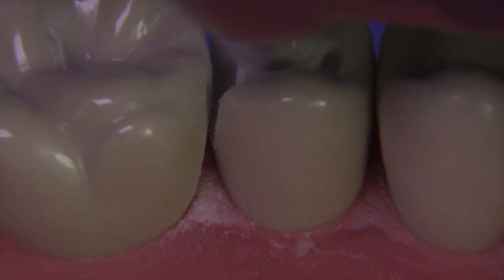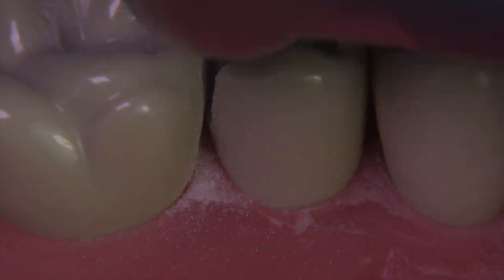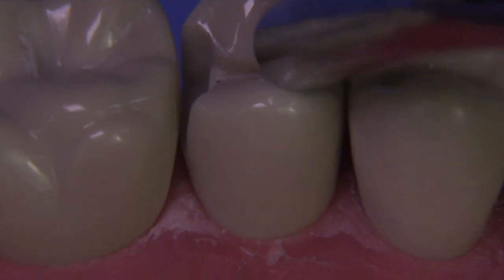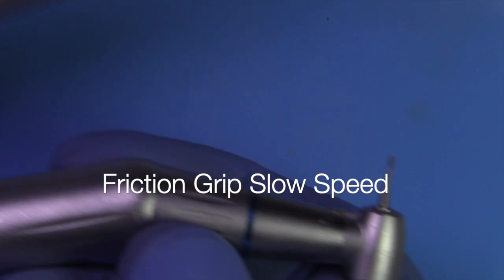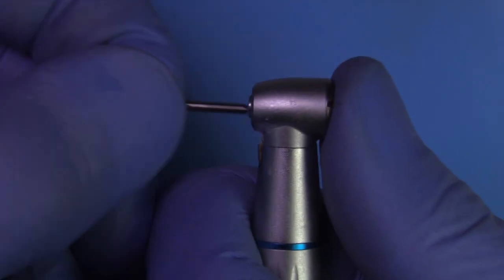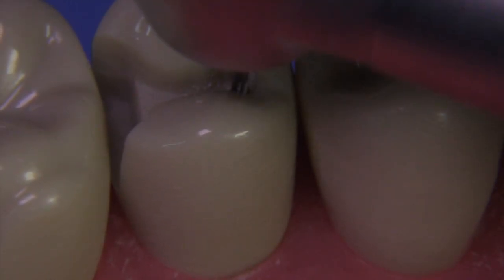I'm going to speed up the video through this part because I want to show you another technique for smoothing with this same burr — utilizing slow speed. Many of you are probably wondering how you can put a friction grip burr into a slow speed handpiece. That requires a special push-button friction grip attachment. Here's my slow speed motor with a friction grip attachment — an E-type connection that can work with electric handpieces as well. It holds all your friction grip burrs, and you can come in and just create some smoothing with the slow speed.